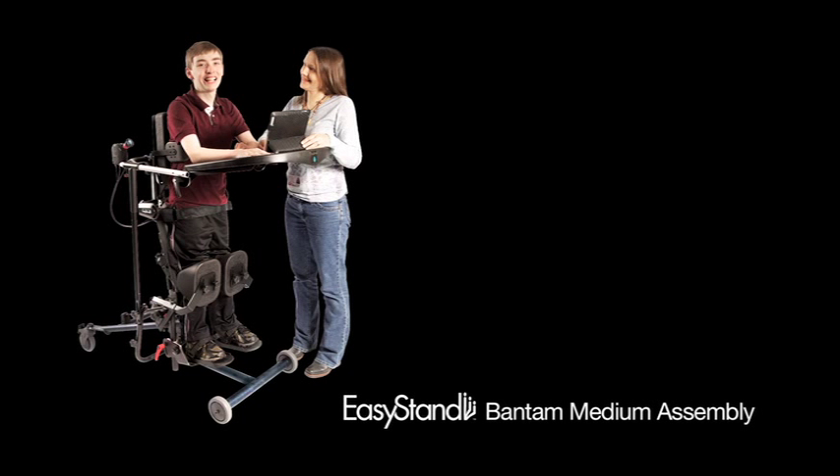Thanks for your purchase of the Easy Stand Bantam Medium. This video will show you the basic assembly of the Easy Stand Bantam Medium.